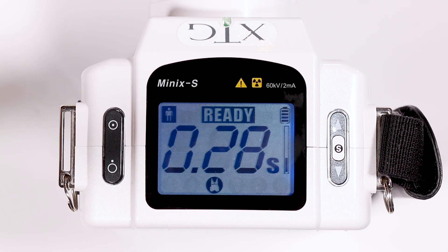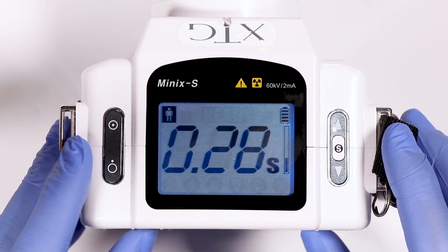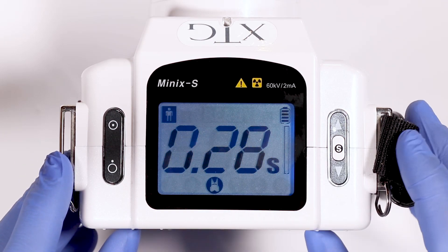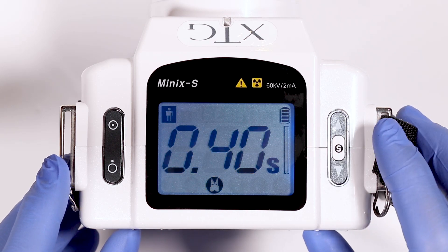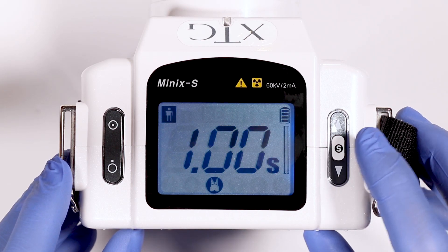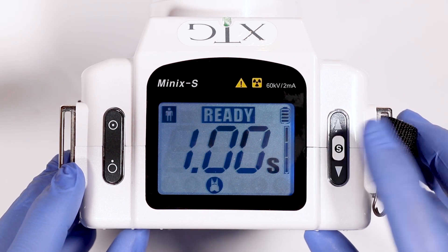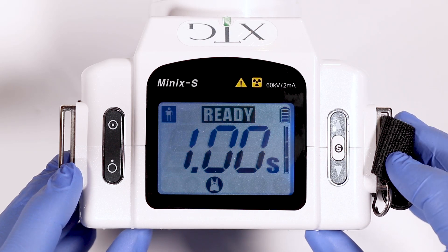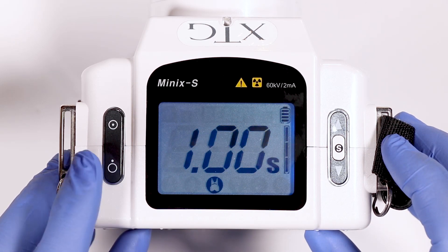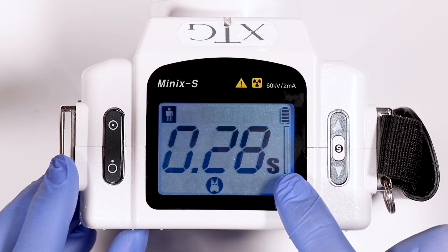To change from digital x-ray sensor to phosphor plate or film, press and hold the S button, then press the power off button two times and you will see the bar flash. Touch the S button and two bars will show — this is the phosphor plate mode. Touch the S button again and it will show three bars, which is your film mode. Press and hold the S button and it will save. To change back to digital x-ray, press and hold the S button, touch the power off button two times, then press and hold the S button and it will save back to one bar, which is your digital x-ray.